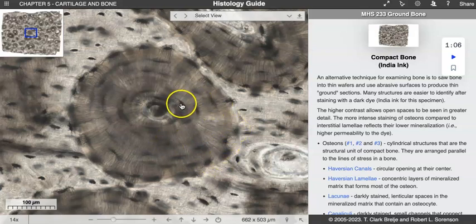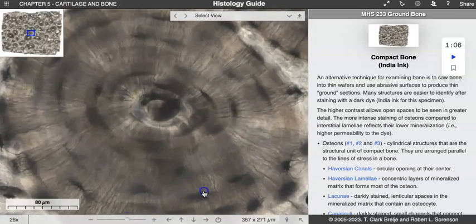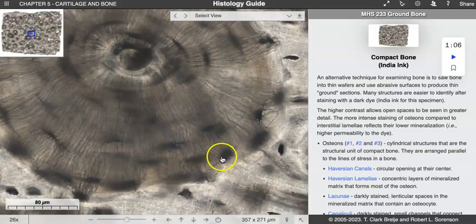Okay, so what would be in here? If this was living tissue and we could go up even higher in magnification, I don't know how far we can go here, we could see that there would be a space, there would be a cell, it would have a membrane and cytoplasm and a nucleus, but we don't see that here. We just see where the cell would exist. And so within this area, you could say this is where the osteocyte would live. This is where we would see a lacuna, or a space that is around that cell.